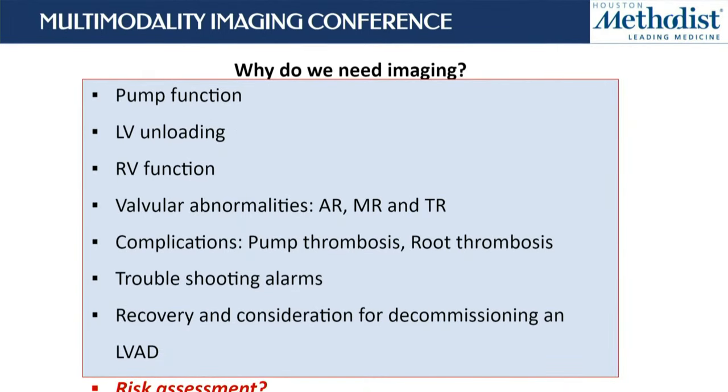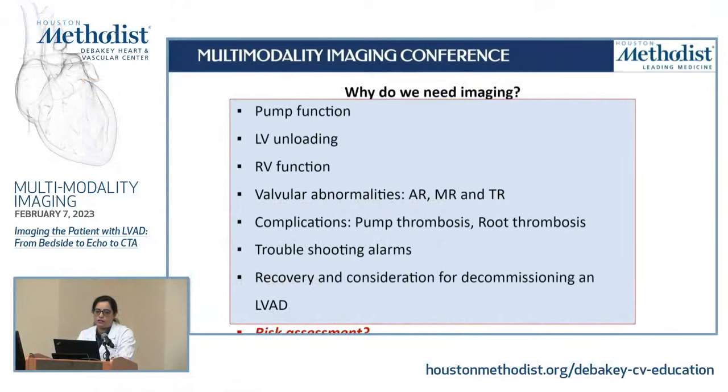Why do we need imaging? We need imaging to understand, number one, is the pump functioning or not? Number two, is the pump causing effective unloading or not? How is it affecting my RV function? Are there any valvular abnormalities, including AR, MR, and TR? And then complications: honestly, pump thrombosis has become obsolete. Again, like I said, people are still on HeartMate 2 support, so we may see it here and there, but it is an obsolete situation with HeartMate 3.